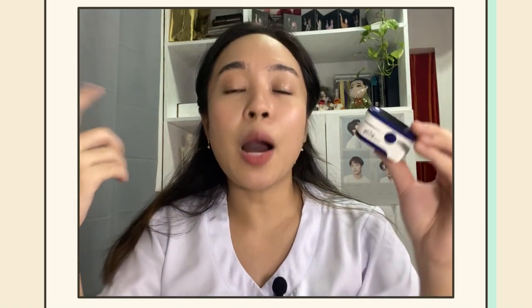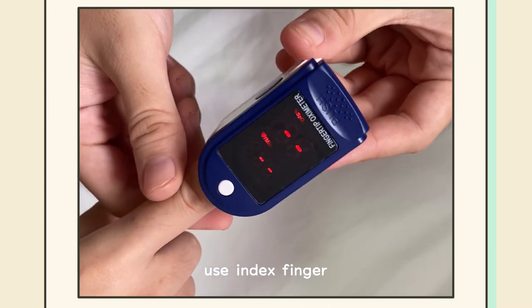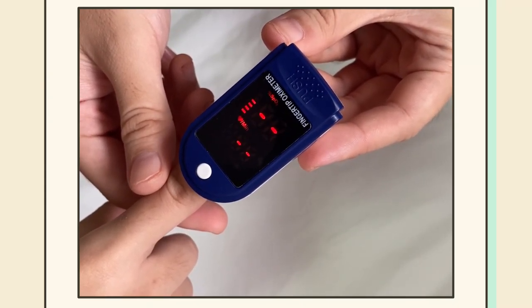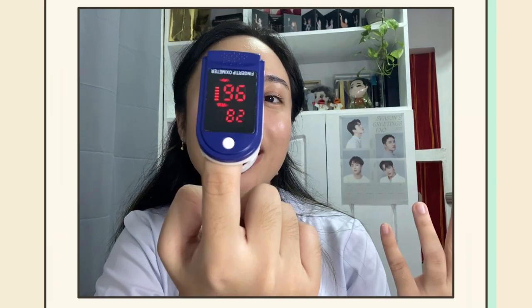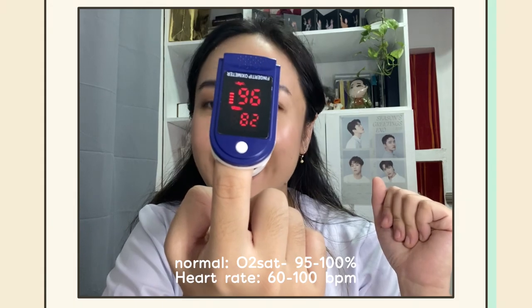To use this, ang pulse oximeter ay kadalasan na ilalagay sa index finger natin or hintuturo. After that, malalaman mo na kung ano ang level ng oxygenation sa dugo. I got 96% sa oxygen saturation and then 81, 82 beats per minute for my heart.